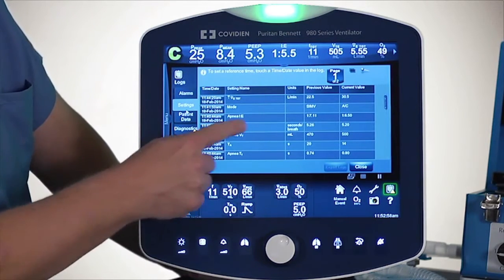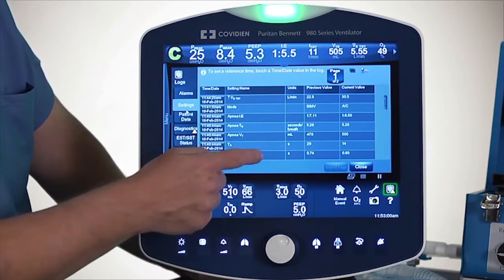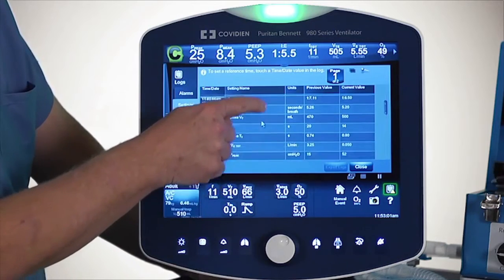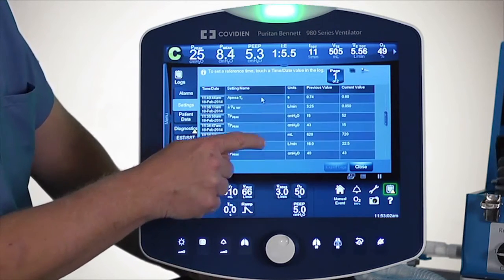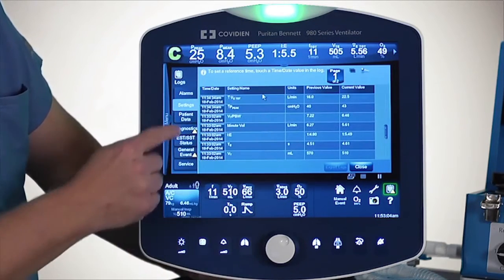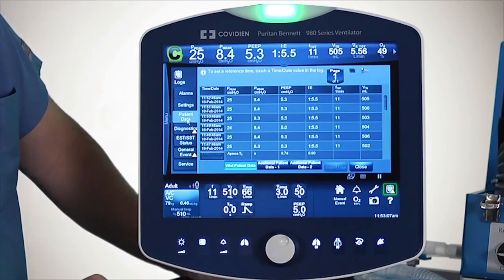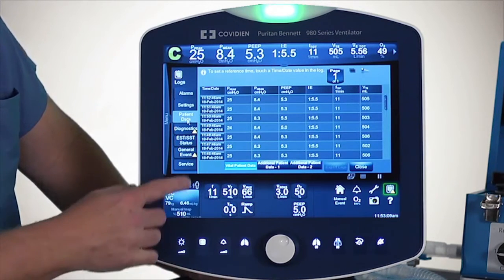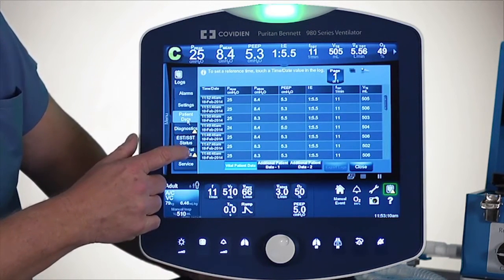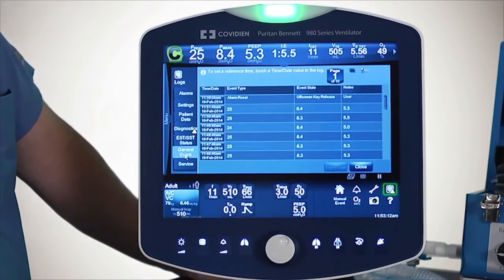This is my settings log and I can save 500 settings, and I can scroll up. I also have a patient data log. And finally, it might be important to also look at the general event log.